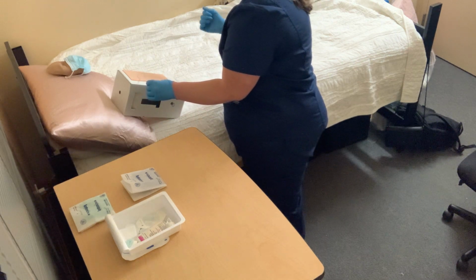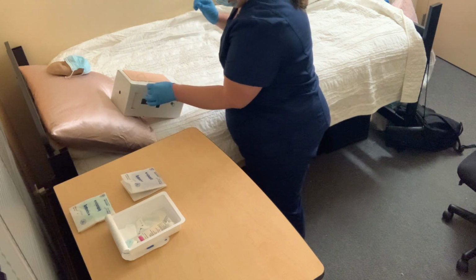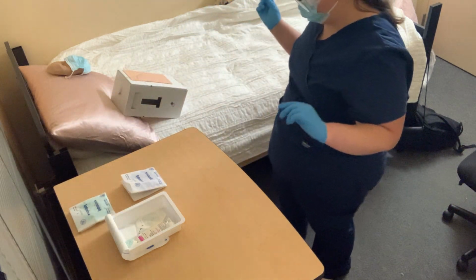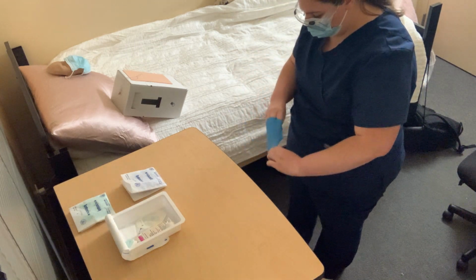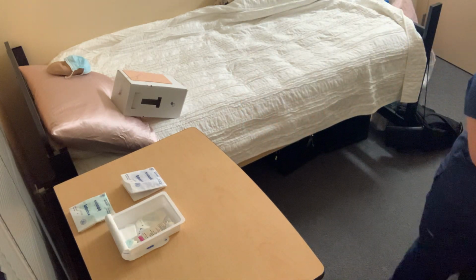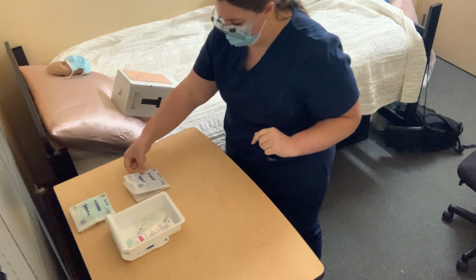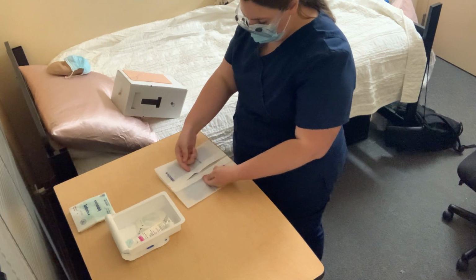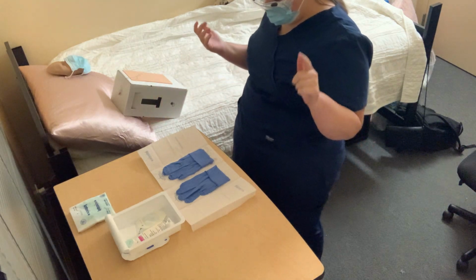And then I'm going to go ahead and measure the tubing to make sure that the tube itself has not migrated since the last assessment. And according to my measurement, it is the same as last time, so the tubing is still in the correct position and place. So now I'm going to go ahead and take off my gloves, do hand hygiene. I'm going to go ahead and put on my sterile gloves. I'm going to start with my right dominant hand.